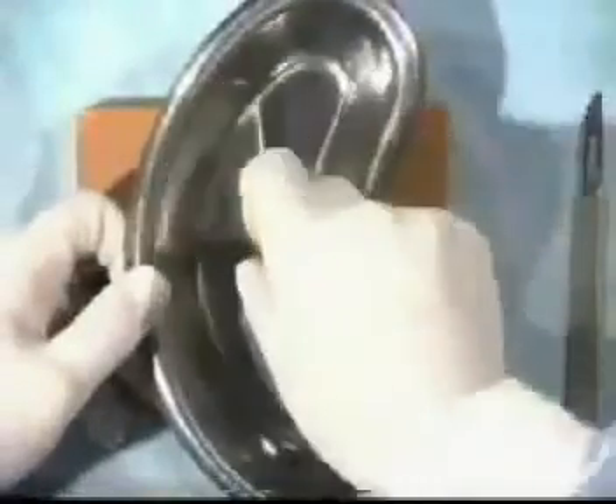However, the safest way is always to put it into a kidney dish and pass it to your assistant or scrub nurse.